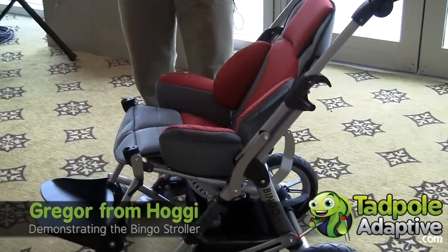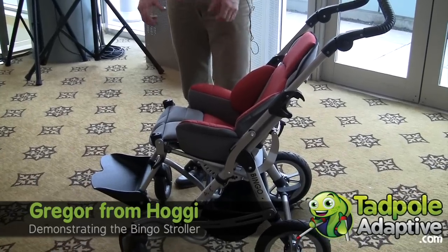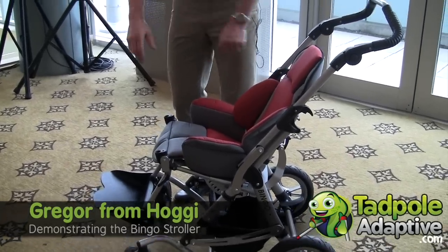The chair comes with multiple accessories like harnesses, abduction block, grab rail, and tray.